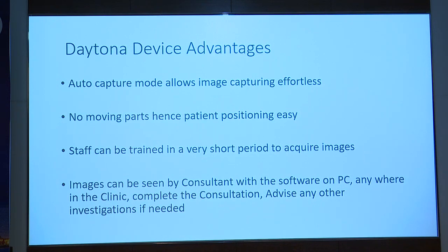You can see, just yesterday, a young patient of mine, a one-eyed young child, started complaining she was seeing some black spots. So they called the patient, did a Daytona, and sent it to me on WhatsApp. I could talk to the father immediately. So it is very good technology to assess patients and counsel them.